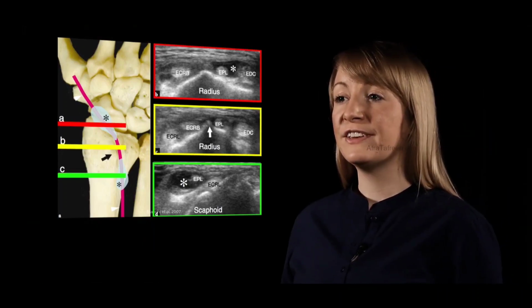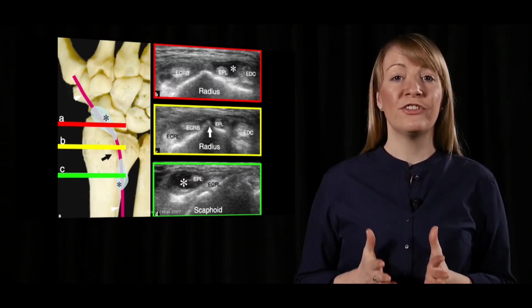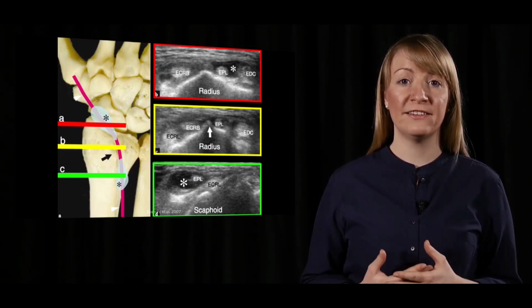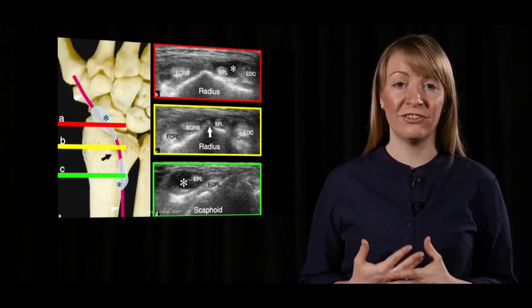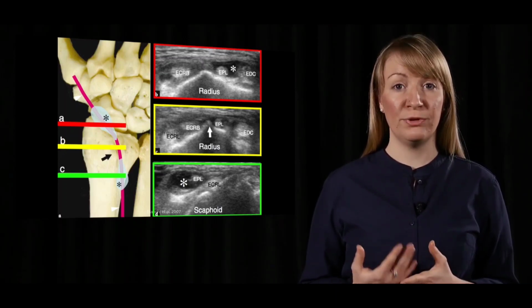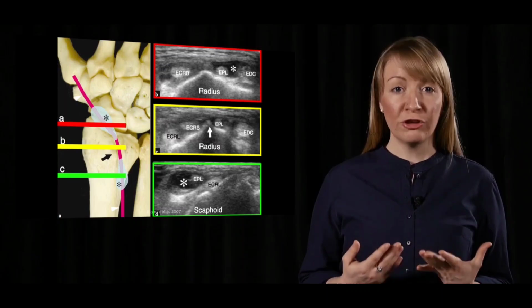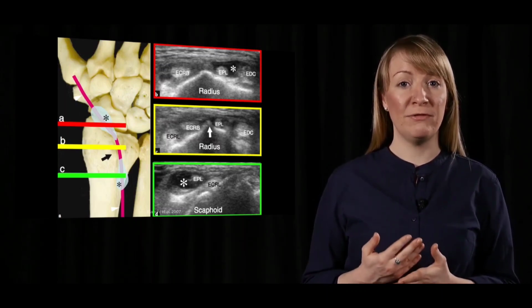The sequence of images demonstrates the course of the extensor pollicis longus tendon relative to the Lister tubercle and the typical clepsydra-like distribution of sheath fluid in a case of tenosynovitis. The narrow tunnel of the third compartment intrinsically hinders the sheath distension of the extensor pollicis longus at the level of the Lister tubercle, except in cases of abundant effusion. Most often, the fluid distributes just proximal to the Lister tubercle, and after the tendon has crossed the extensor carpi radialis longus.